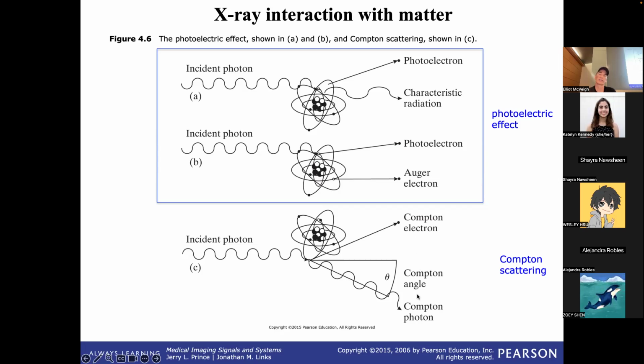This is also a good way to eliminate photons on their pathway through a patient, because if this angle is high enough, when that photon comes down to my target it will be coming at a specific angle such that I can filter it out with an anti-scatter grid. By the time we get to photons of energy around 100 keV, this type of interaction produces 99% of the reduction in incident photons. We'll see the relative amounts, but there's basically the photoelectric effect, where the photon goes away, and the Compton scattering.